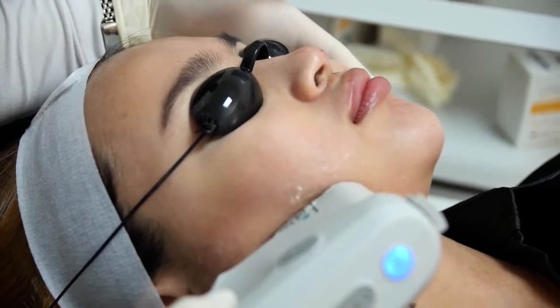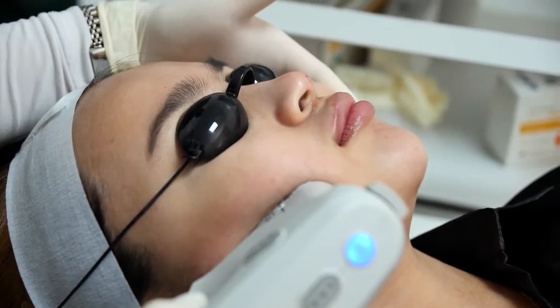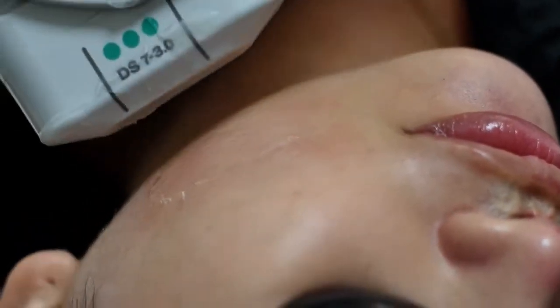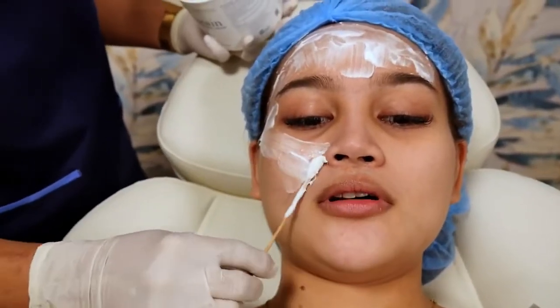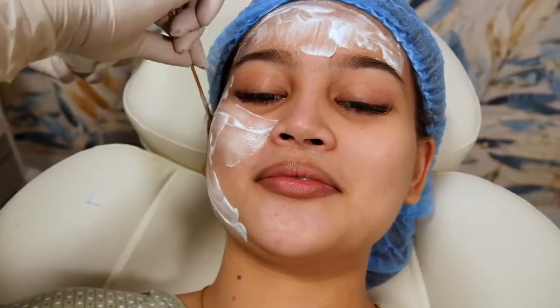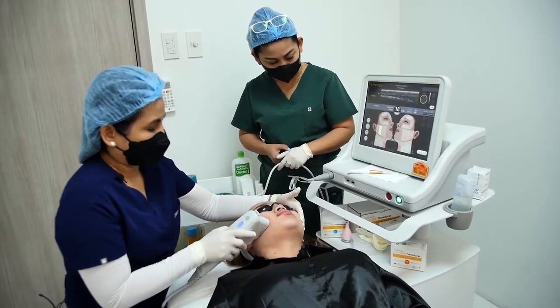So you actually have an Ulthera treatment whereby you feel some tiny clicks, right Casey? But so far so good. I'm using a so-called vapor coolant, a cold spray to numb the skin region. For those people who are always in a hurry and cannot wait for the topical numbing cream — usually we leave it for 45 minutes to an hour — if they want something fast that will give a very good anesthetic effect, you can make use of Pain Freeze.